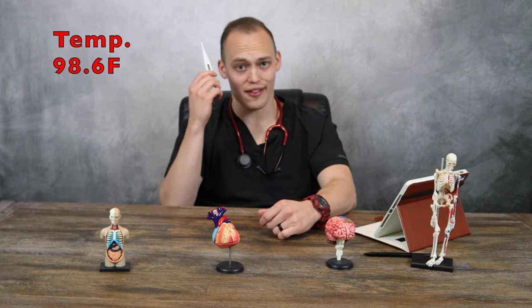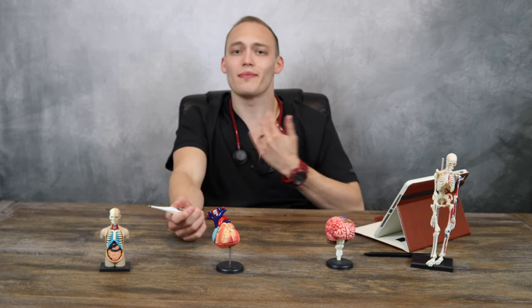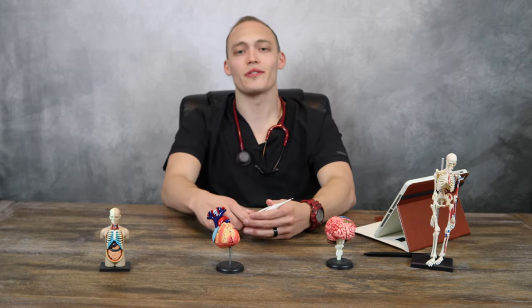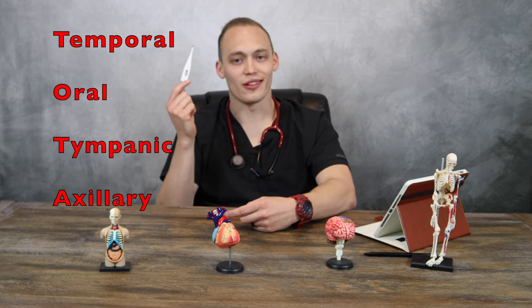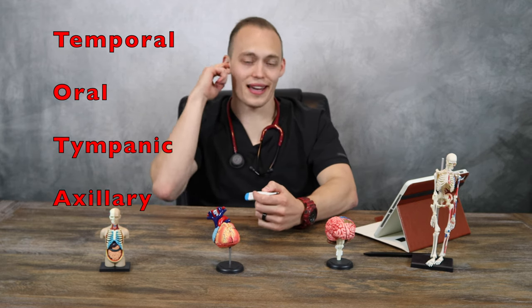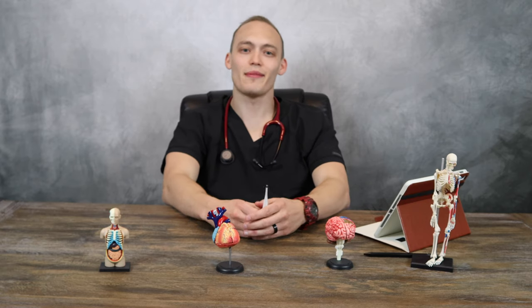After blood pressure, I like to do temperature. The average temperature is 98.6 — remember that it's an average. So if your patient comes in with a temperature of 97.9 or 99, that's fine. It's 98.6 plus or minus one degree generally. Temperature, like heart rate, can be assessed in many locations. You can do the temporal with scanner gadgets, tympanic, axillary, and everybody's most feared — the rectal route. Rectal is going to be the most accurate because it gives us an internal reading of how warm or cold the patient actually is.